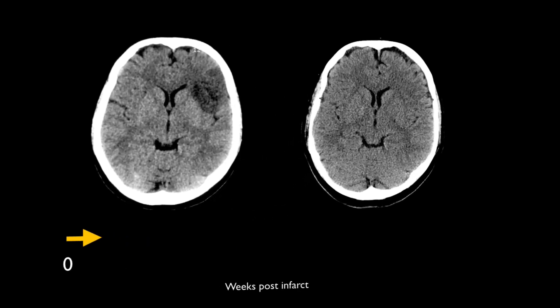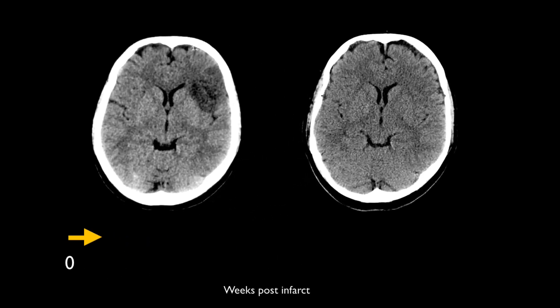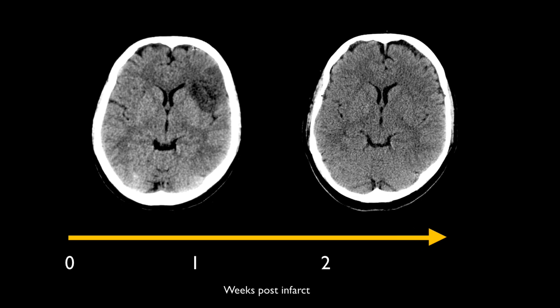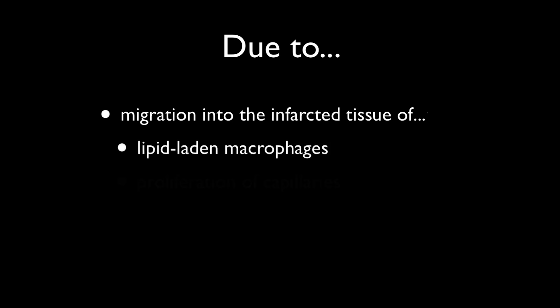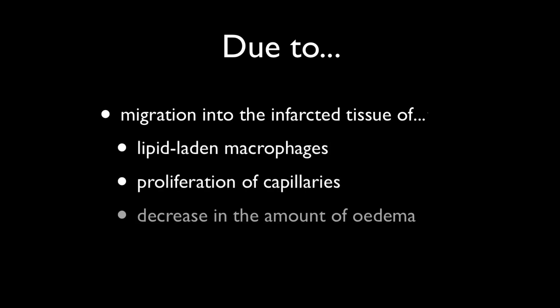Classically, CT fogging is seen during the second and third week following an infarct. A number of processes have been implicated, including migration into the infarcted tissues of lipid-laden macrophages, proliferation of capillaries, a decrease in the overall amount of edema, and cortical laminonecrosis.